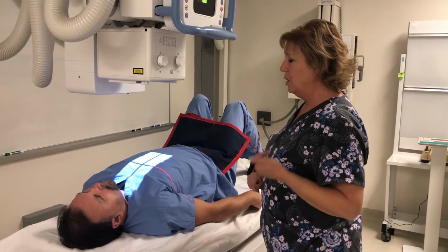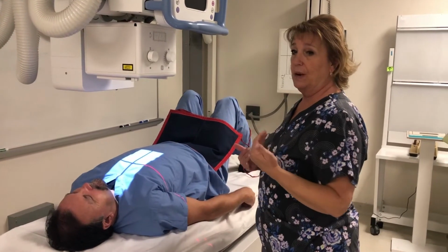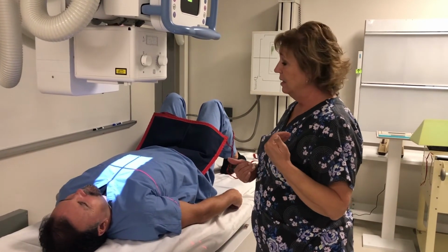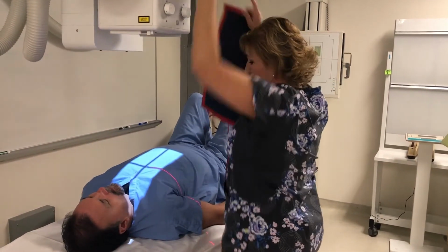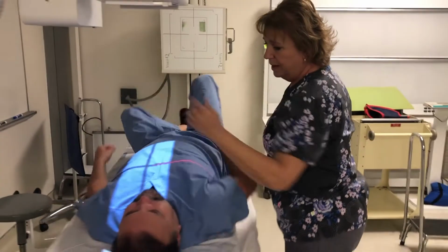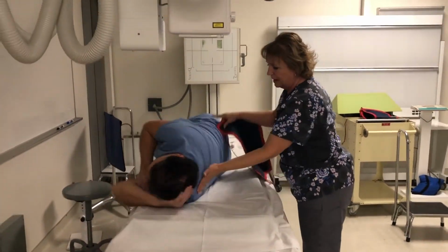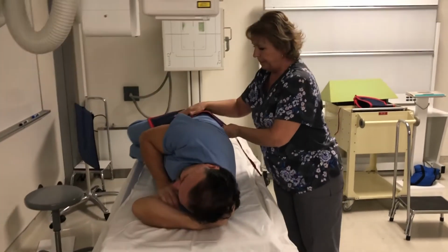I'm going to go ahead and demonstrate the lateral thoracic spine, and then I'll demonstrate one of the AP obliques. Okay, for this next projection, what I first want you to do is slide toward me a little bit on your back, and now roll all the way onto your left side. Bring your shoulders back toward me. There we go.